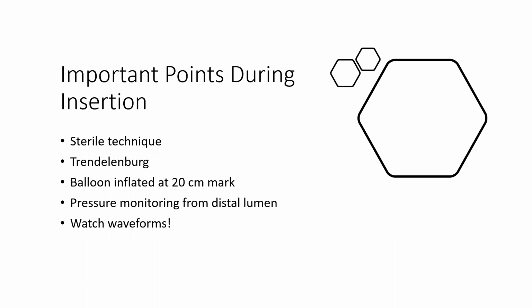And you might need extra sterile towels around the head, shoulders, and chest to ensure that aseptic technique is not compromised. So you probably are going to say, are they going to do this procedure in the OR, in the cardiac cath lab, or at the bedside? And it could be done in all three areas. And that is why if you work in critical care, you need to be familiar with this particular catheter or procedure.